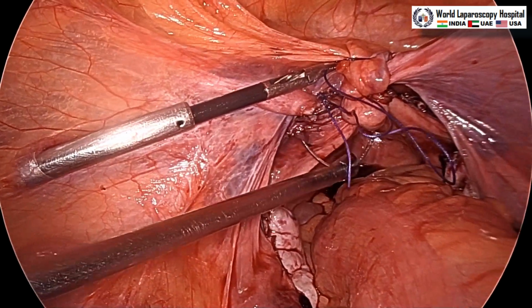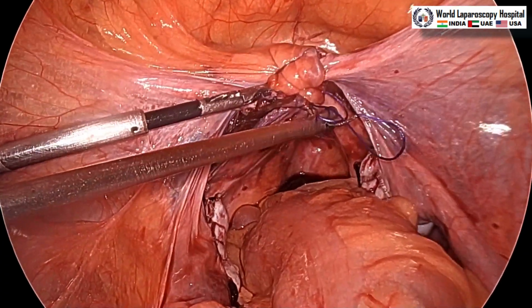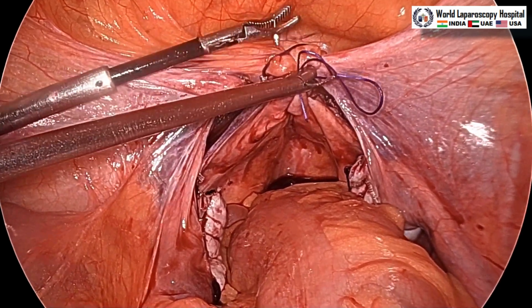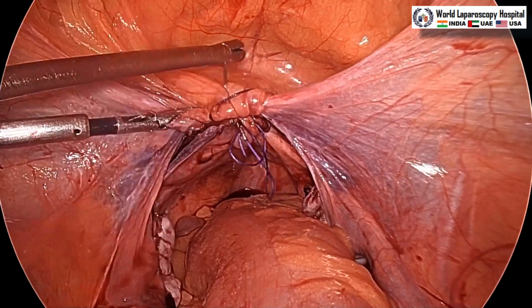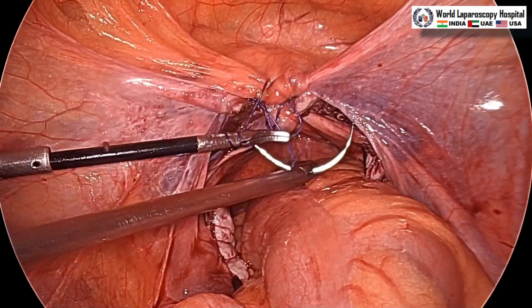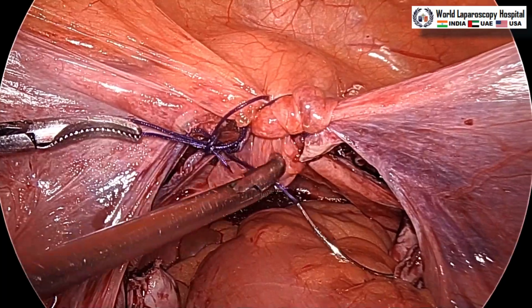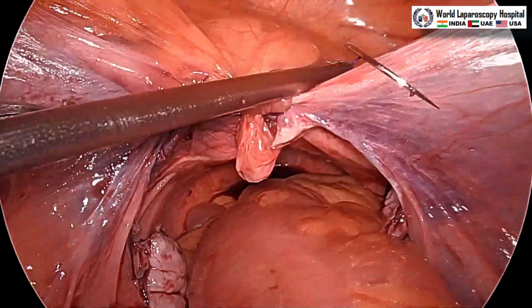So, this is the peritoneum, the posterior peritoneum of the left side, and all is sutured together. So, it will cover the peritoneum also nicely, and after that we will terminate the suture.